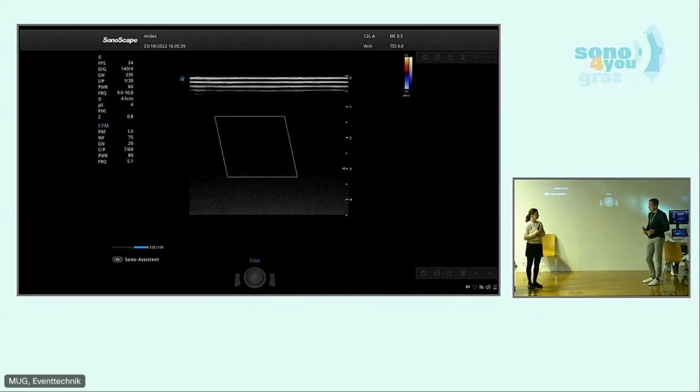For the vein system there are no really standardized rules for deep veins and muscle veins, just the big ones. So when you see one, try to compress it. Okay, so there are no rules for these other locations. Okay, then thank you very much.